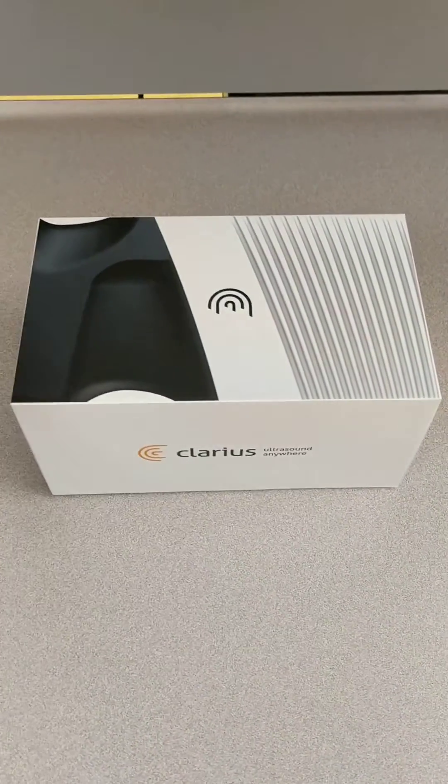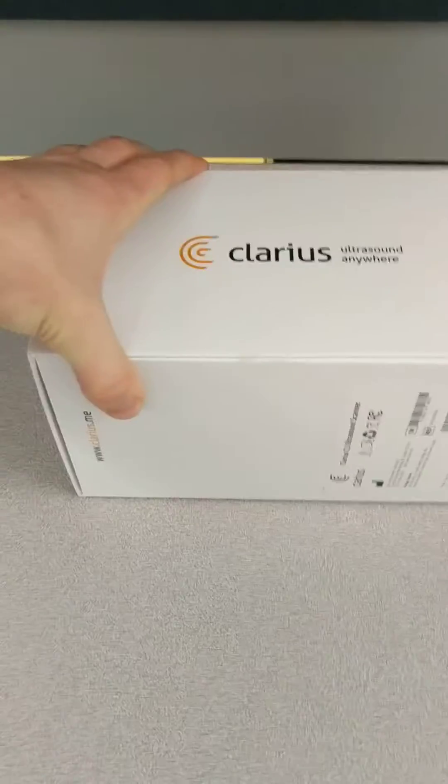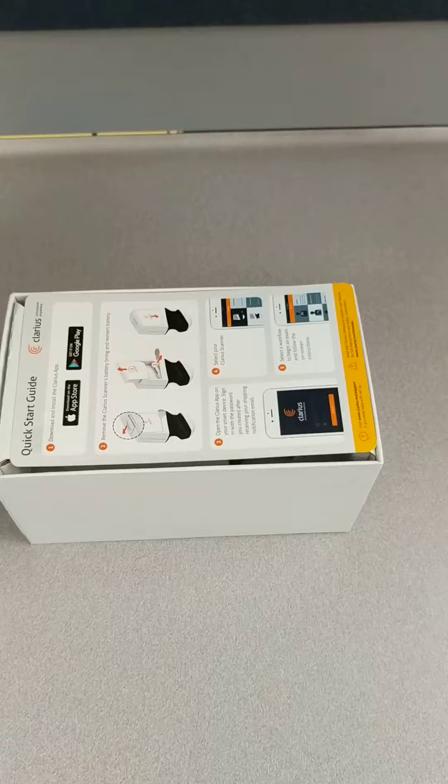So let's see what's inside. For perspective, it's just a really small box — really minimal markings, looks very sleek, and it opens smoothly.